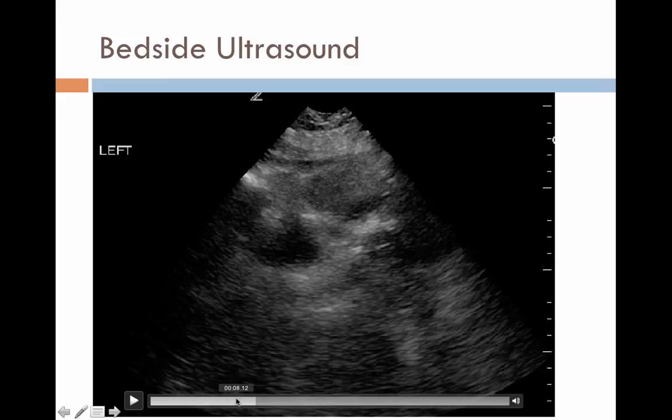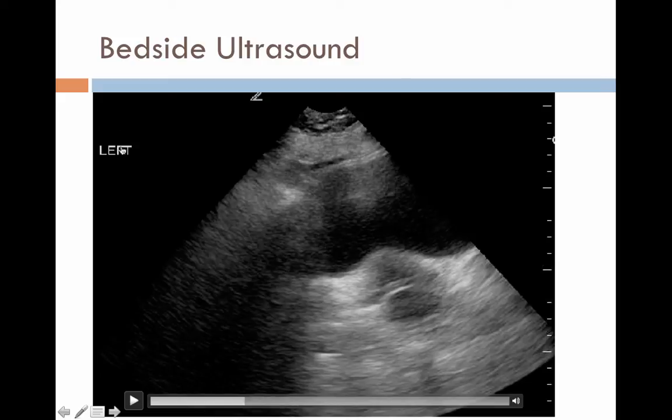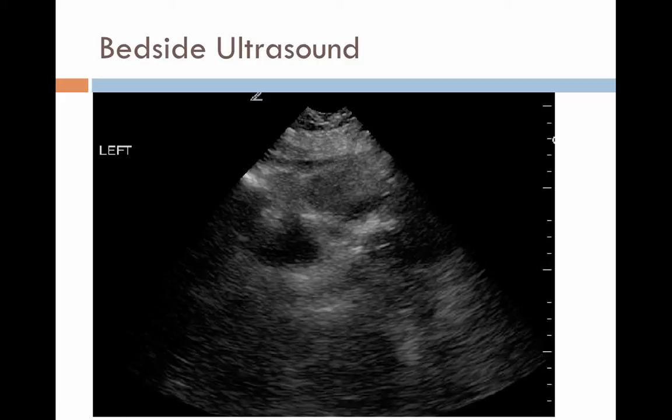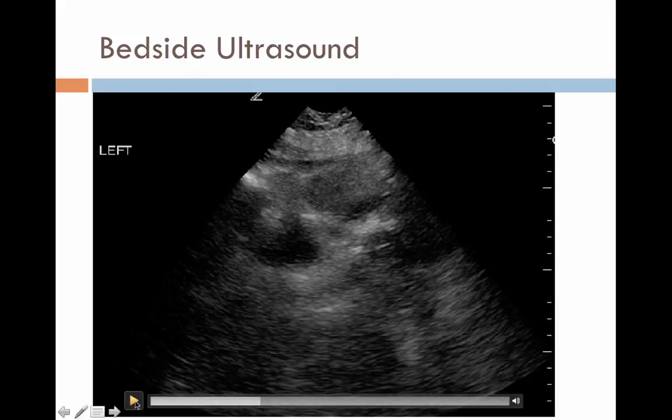And then I'm going to stop there for a second and take a look. It's not the left anymore, but in trauma patients sometimes you forget the labels. And so here's her bladder, right? This is probably the lower part of the cervix and rectum, but it looks pretty clear here. There's no fluid behind her bladder, so that looks pretty good. But then we scan up through this towards the fundus of her uterus, and we see in her pelvis here, again, ignore this left marker, we definitely see some fluid in this patient's pelvis. And this is one good lesson in the female trauma patient. You have to find the uterus and look behind the uterus for fluid, because the fluid doesn't go behind the bladder, it goes behind the uterus, the pouch of Douglas.